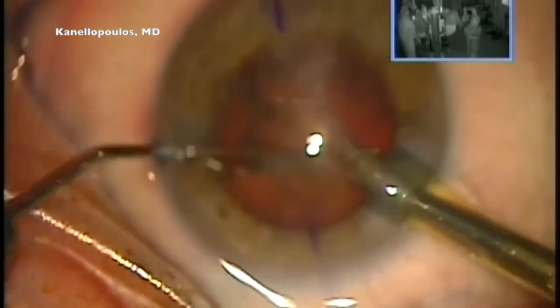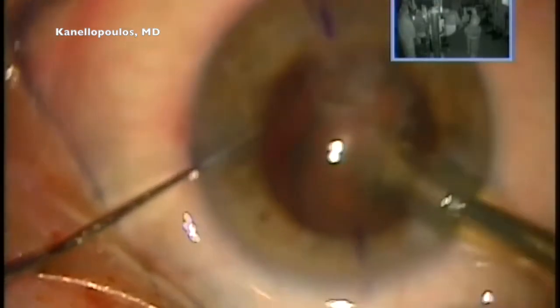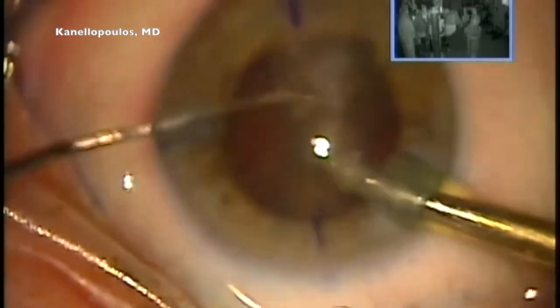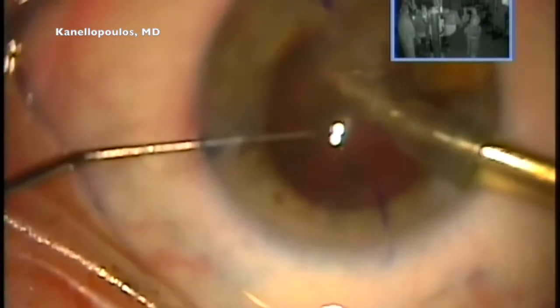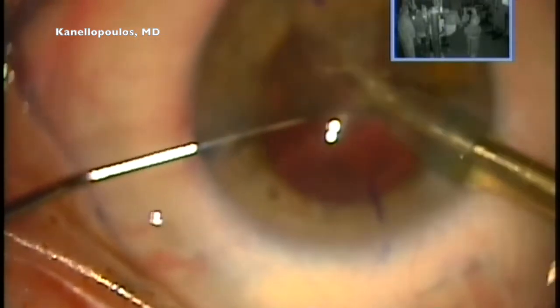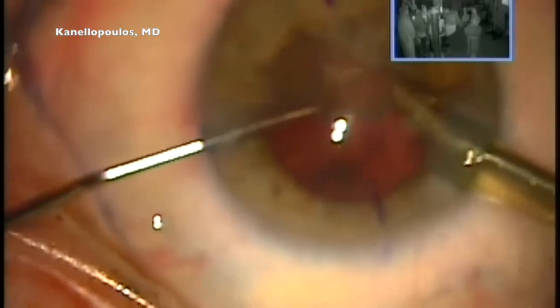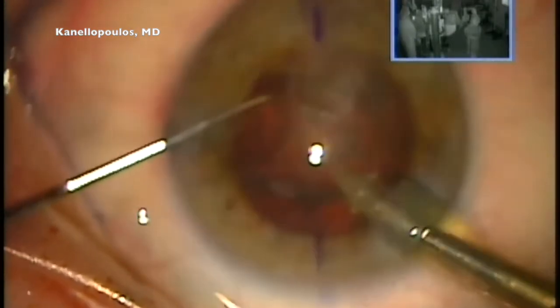We can see here rotating the other half of the cataract and picking up the other half of the lens, and completing our phacoemulsification of the cataract nucleus. Again, we're at the pupillary aperture level, away from the cornea and away from the posterior capsule.